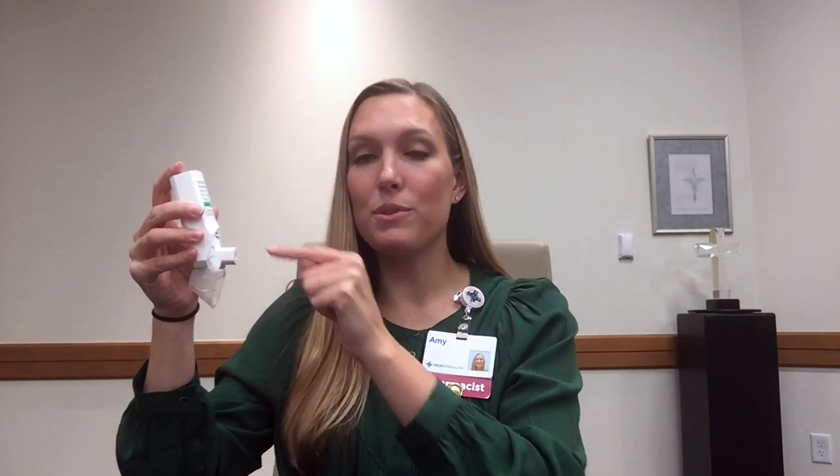Inhale and exhale fully away from the inhaler. Next, place the inhaler in your mouth, completely surrounding your lips around the mouthpiece. Inhale quickly and deeply for the full dose.